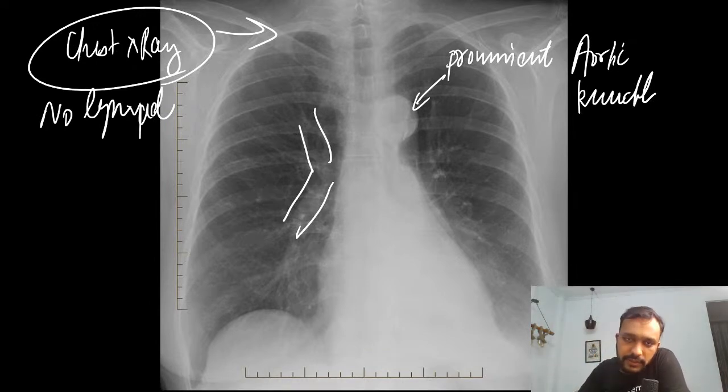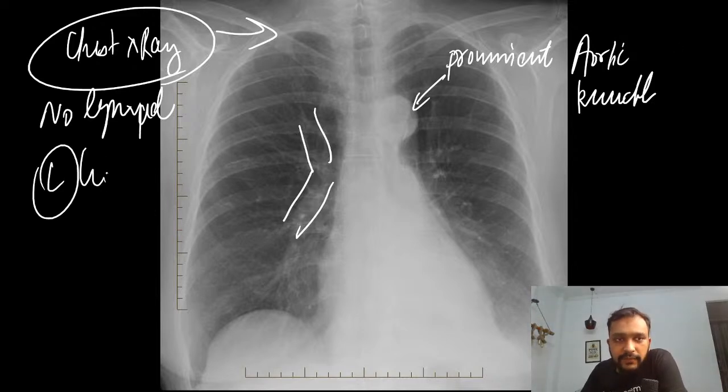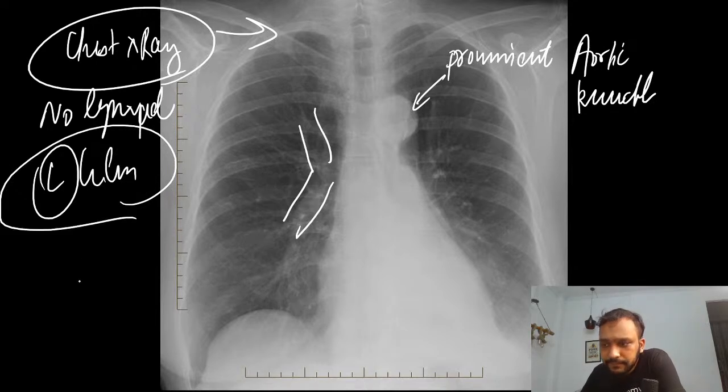Anything else that you can think of in this chest x-ray? Can you see the left hilum? How many of you guys can see the left hilum?